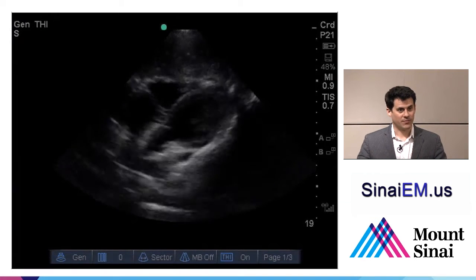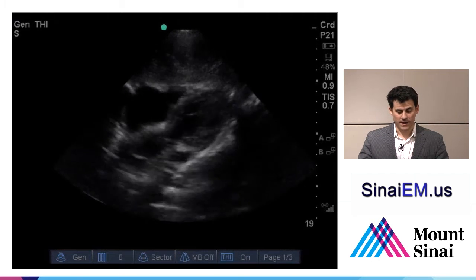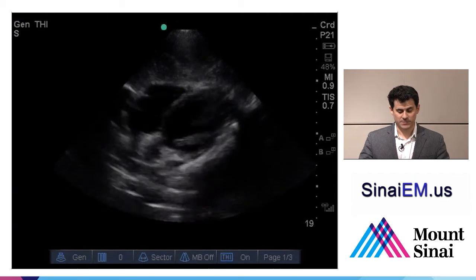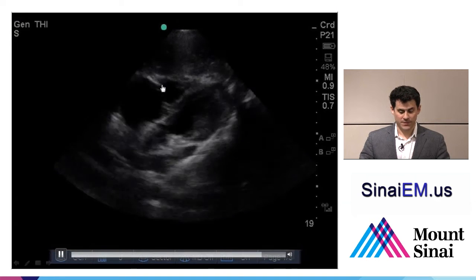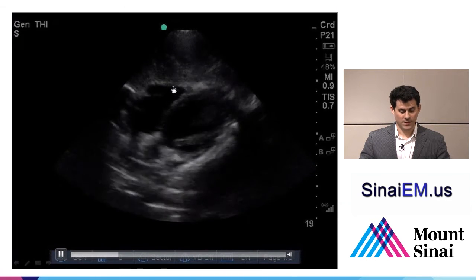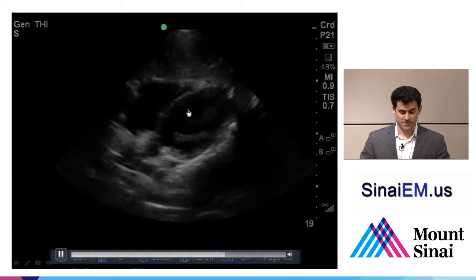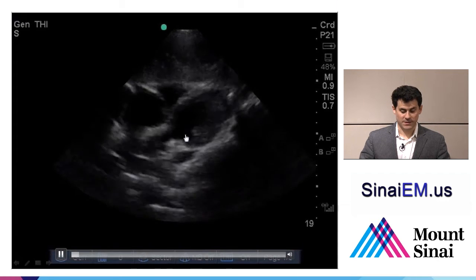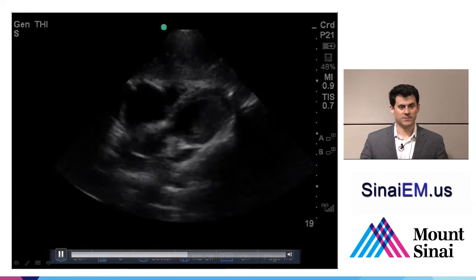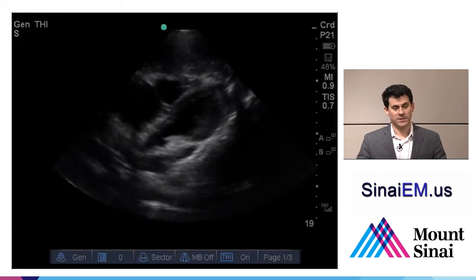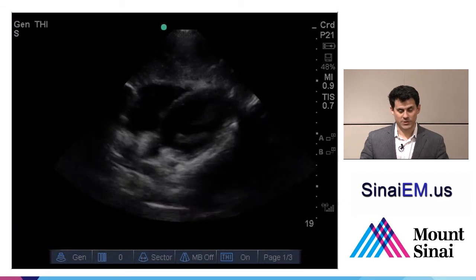This is what a sub-xiphoid cardiac view looks like. At the top of the screen we see the liver, and just deep to the liver, bright white pericardium, followed by the right ventricle. Below the right ventricle we see the septum, and deep to that, the left ventricle. Just looking at this image, we can get some sense of cardiac contractility and confirm there's no pericardial effusion.